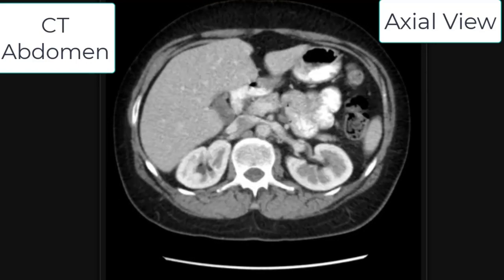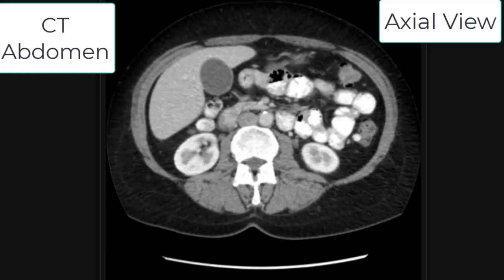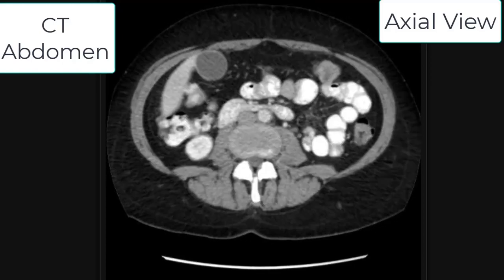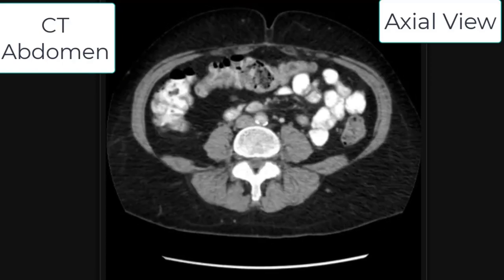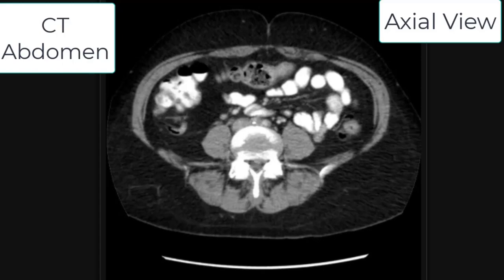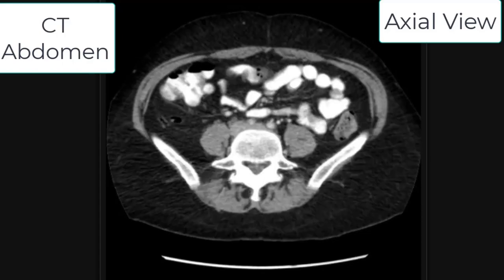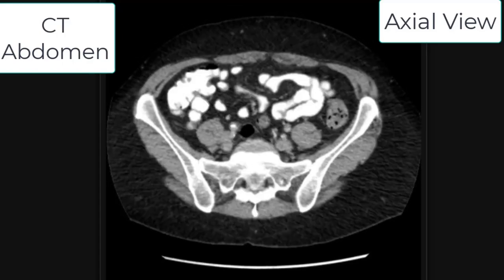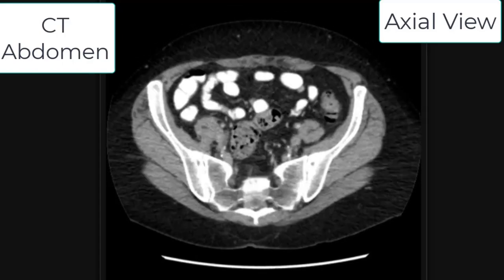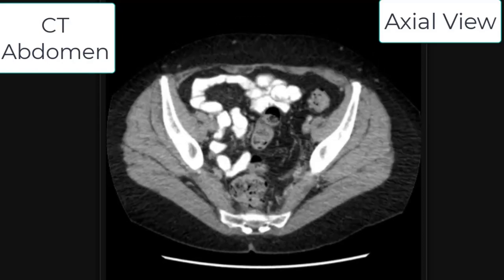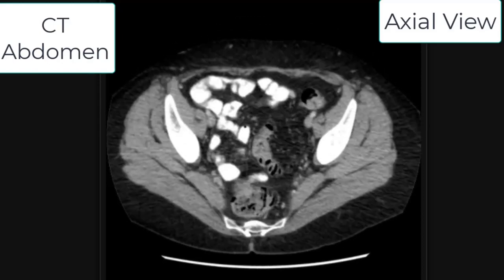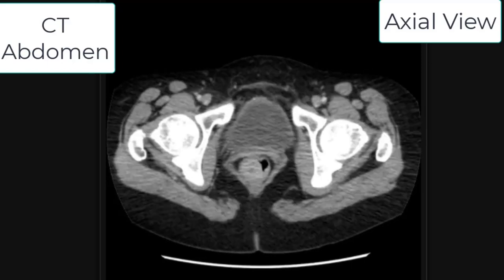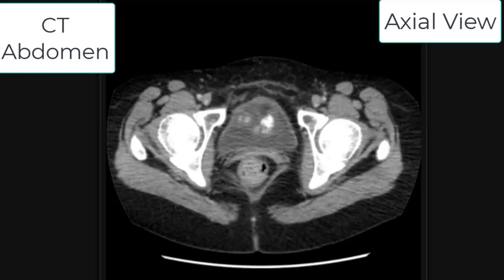This is the CT abdomen in axial or transverse view, going from upwards to downwards. It first shows the liver, kidney, and spleen, and going downwards now shows the intestines and then the pelvic viscera, including the urinary bladder.